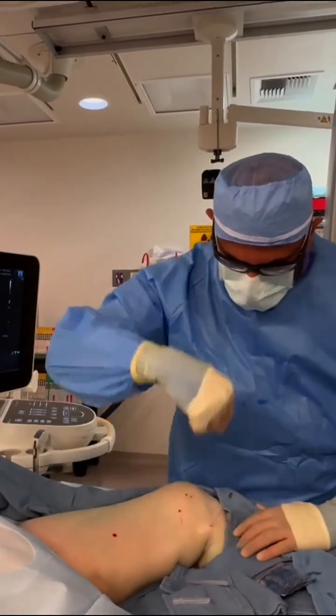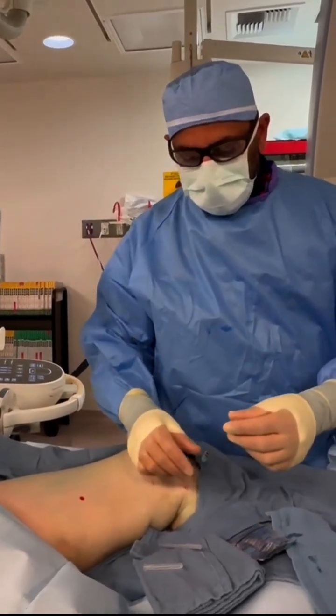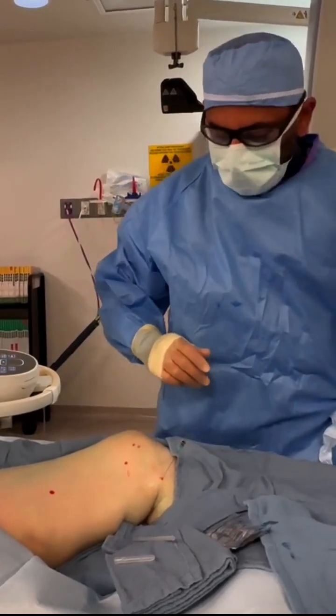You can see the axis is straight down the knee into the pop. We'll go ahead and take a fluoroscopy shot. This is perfect.